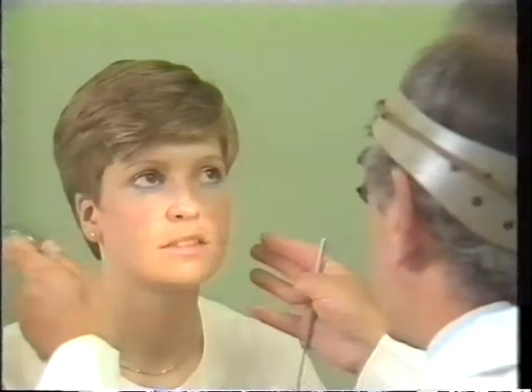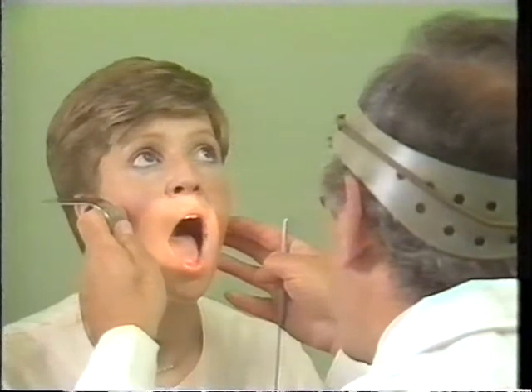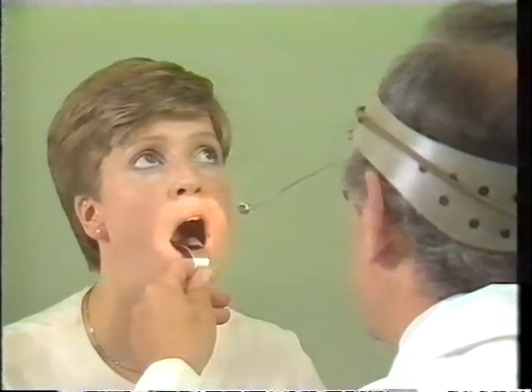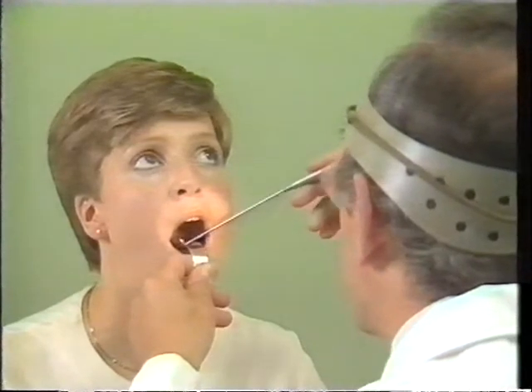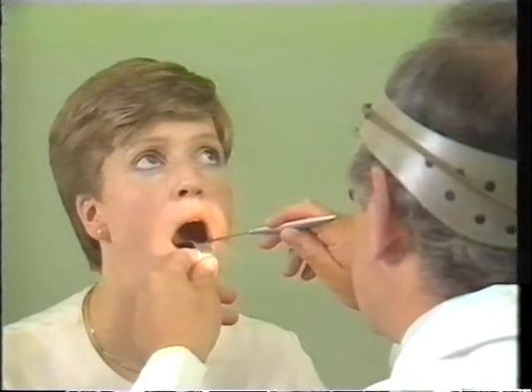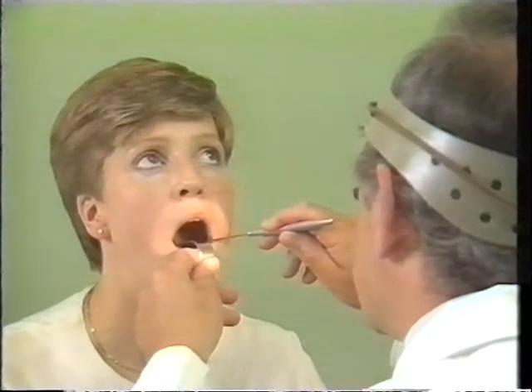The patient's mouth opens, and the tongue is depressed with a lax tongue depressor, and the mirror gently introduced to view the region above the soft palate, which of course is the postnasal space. We can see here the eustachian orifice on the right side.